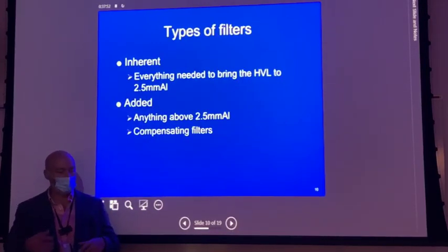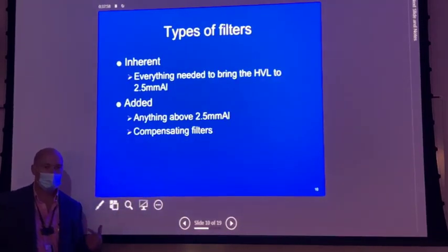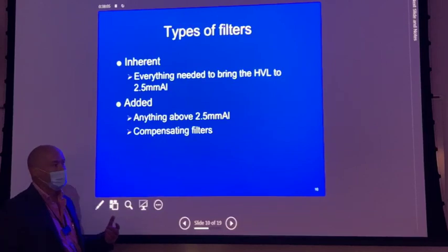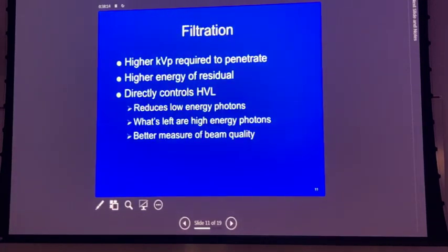They're nice and curved, and you would put that right at the curve of the shoulder, because in a lot of cases you would burn out the greater tubercle, maybe the AC joint, things like that on the lateral side of the shoulder. The rest of the density looked good, but that was just too light. So compensating filters compensate for differences in tissue density.